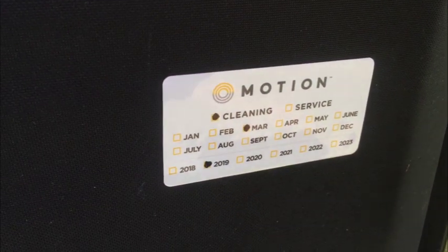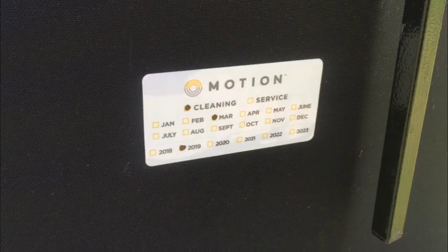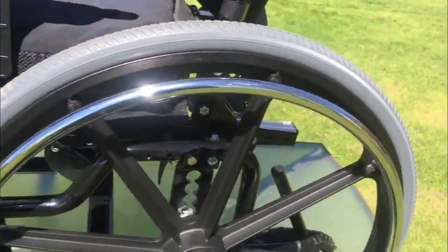This chair has seen very light use, but it was just cleaned this year by Motion Clean — a service that cleans these chairs because they can get somewhat dirty. But as you can tell by the condition, it didn't really need that much because even the print work and the bright work is perfect.